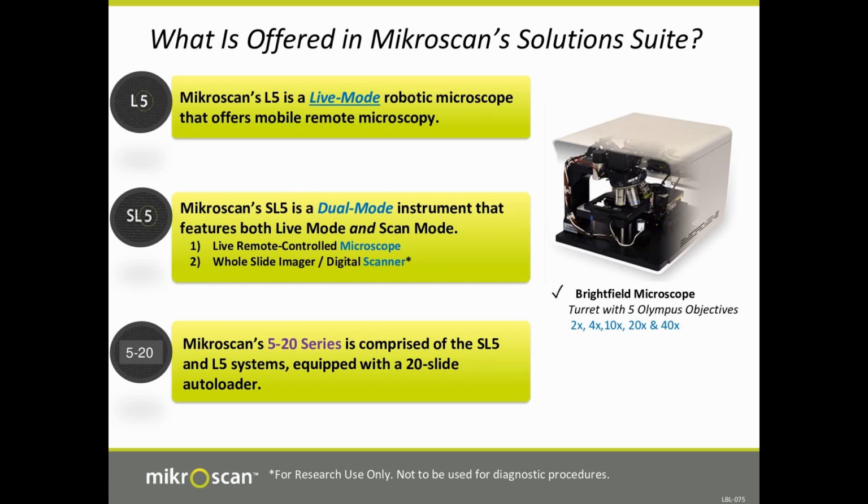That's another big advantage. A lot of whole slide scanners will just produce one image plane, and it may or may not be at the right focal plane to make a diagnosis. That's why validating a whole slide imaging device is so important, because you're only getting one focal plane, which is a very big difference in pathology compared to microscopes.